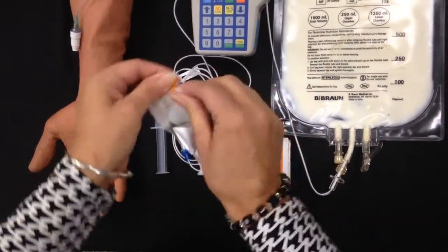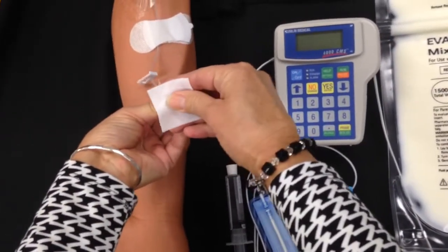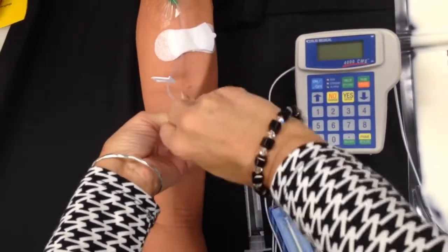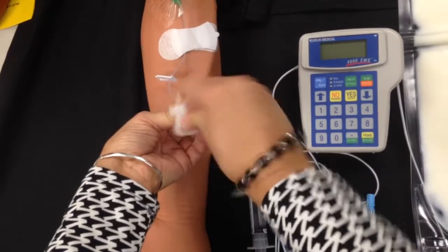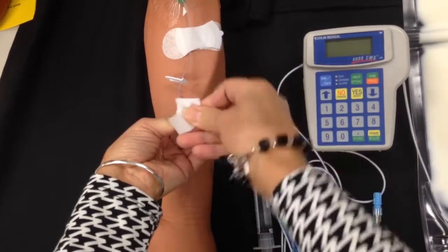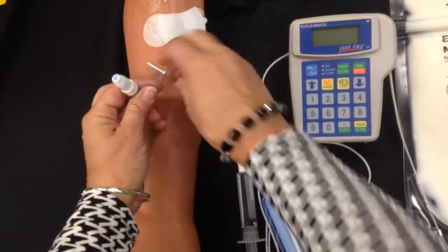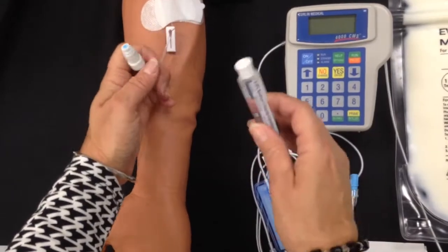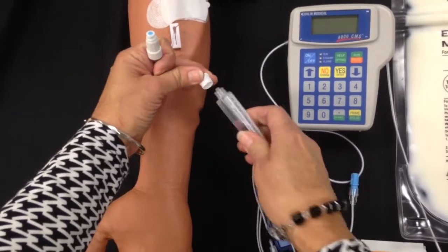Okay, we need an alcohol wipe. Going to alcohol wipe the patient's injection cap for a full 15 seconds. The sides, but especially the top. Okay, you need to make sure this clamp is open, if there is one on the line, and you may need to get some extra help to hold the injection cap so you don't touch anything.